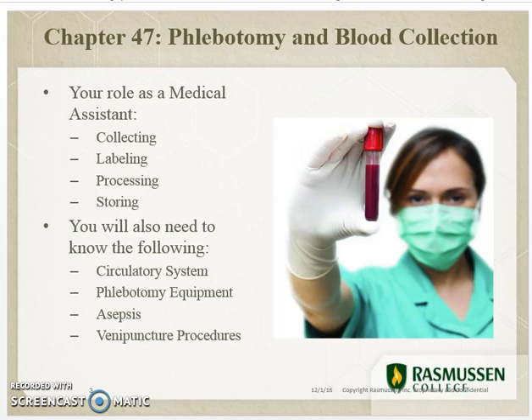And you may hear me throughout the video say phlebotomy or venipuncture, but please know that these refer to the same thing. So when we are talking about phlebotomy, it is the collection of blood through a tiny incision in the vein, and that's typically done with what we call a hollow needle.